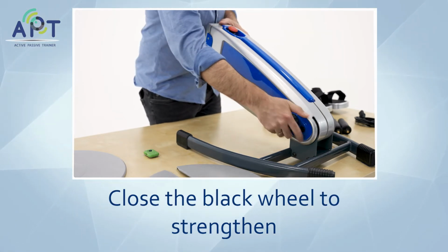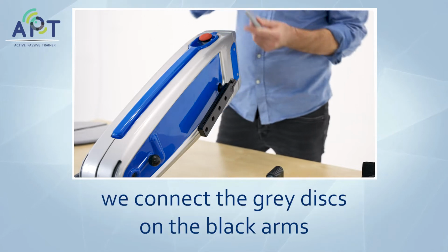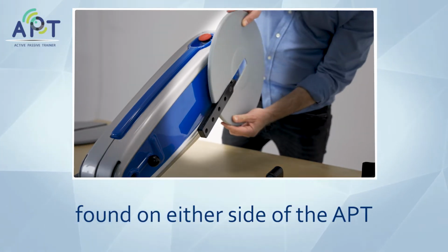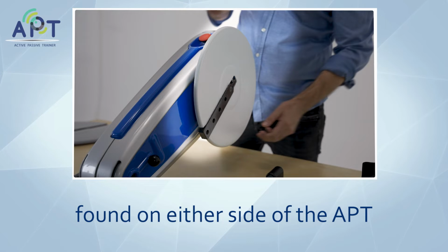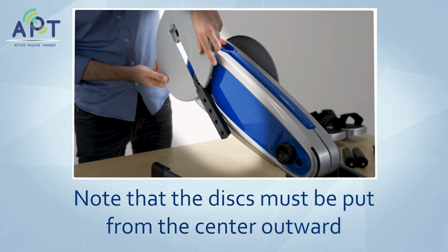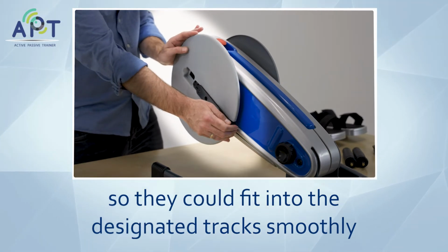Close the black wheel to strengthen. After adjusting the desired height, we connect the gray discs on the black arms found on either side of the A.P.T. Note that the discs must be put from the center outward so they could fit into the designated track smoothly.